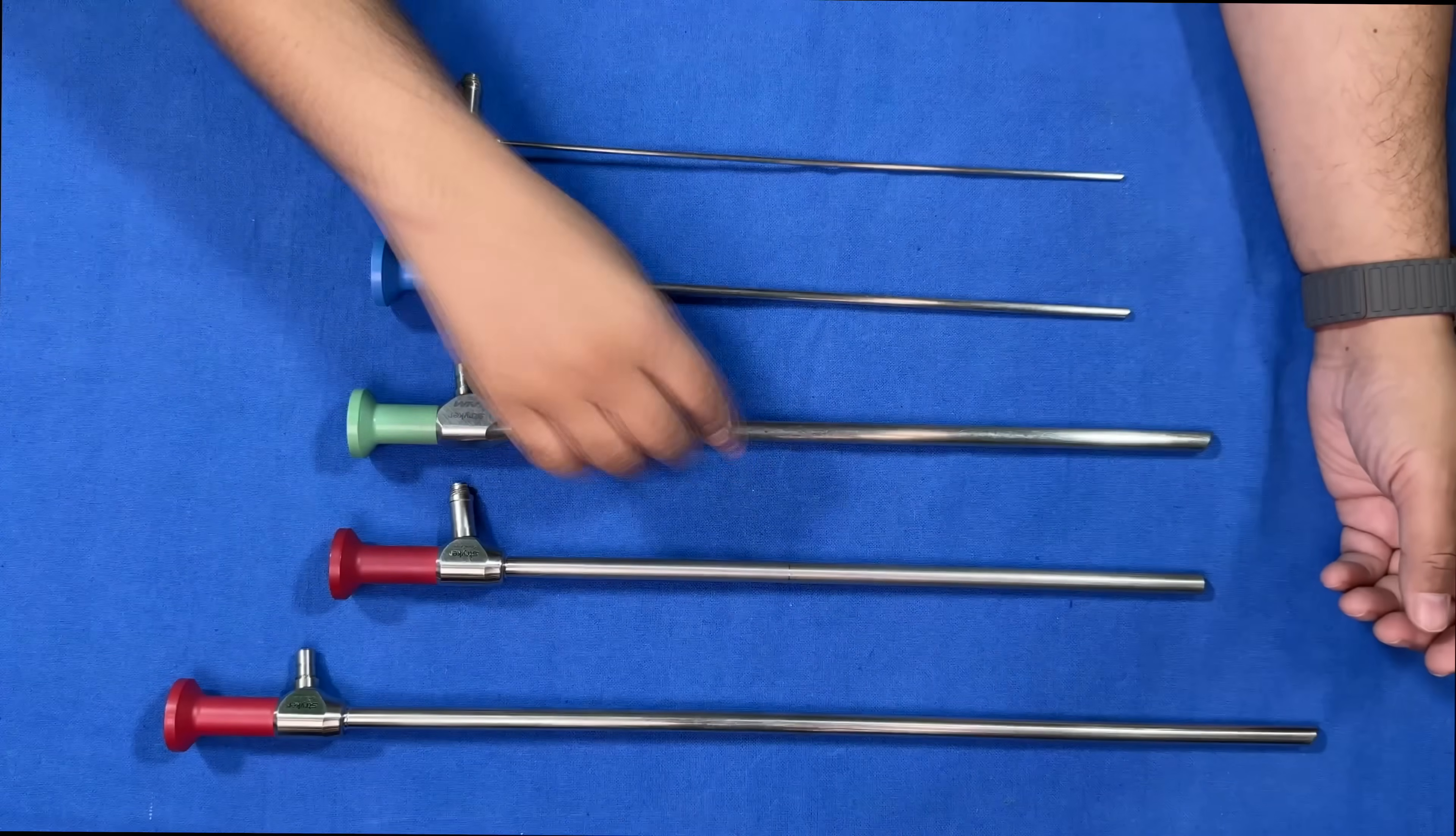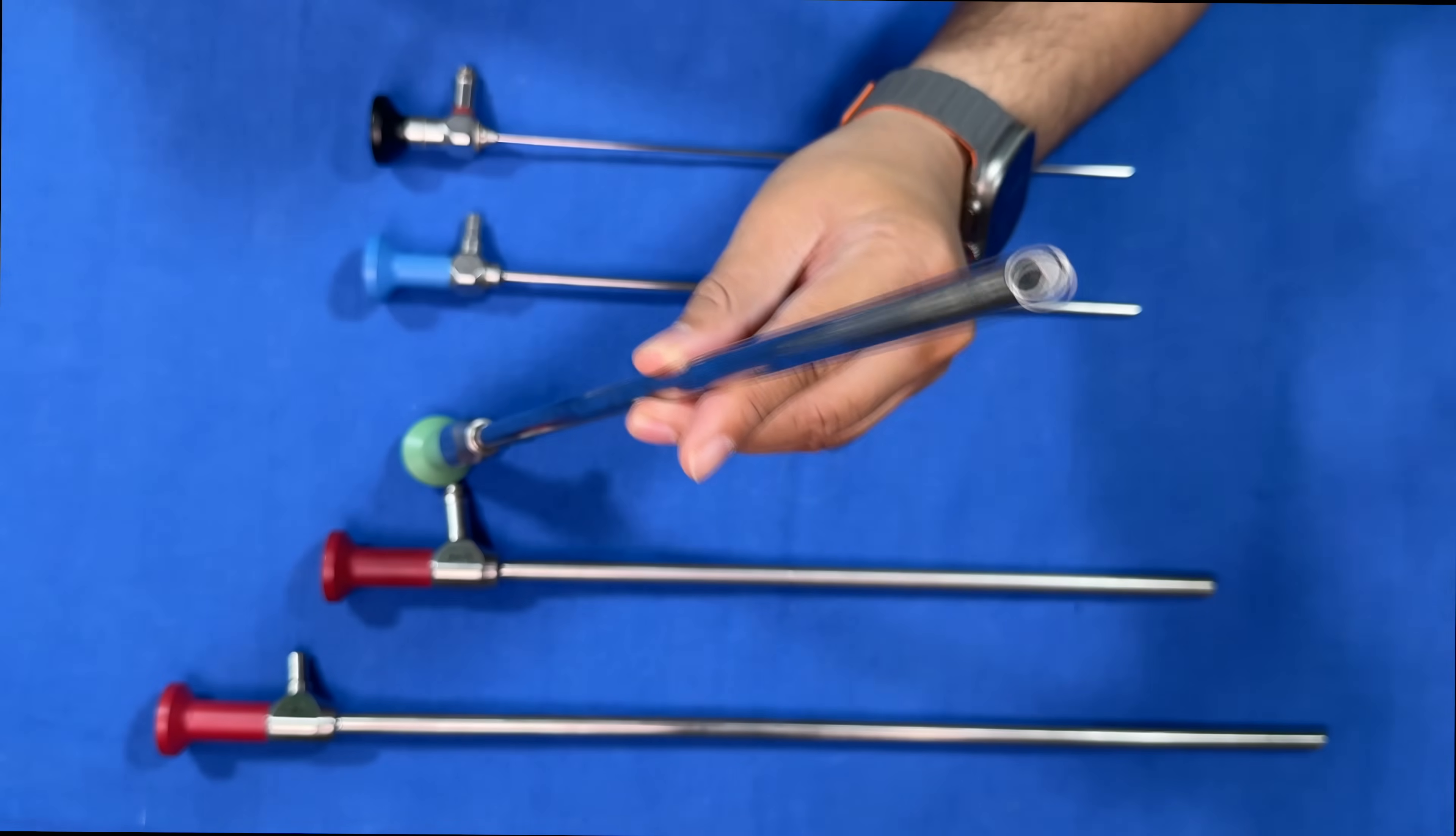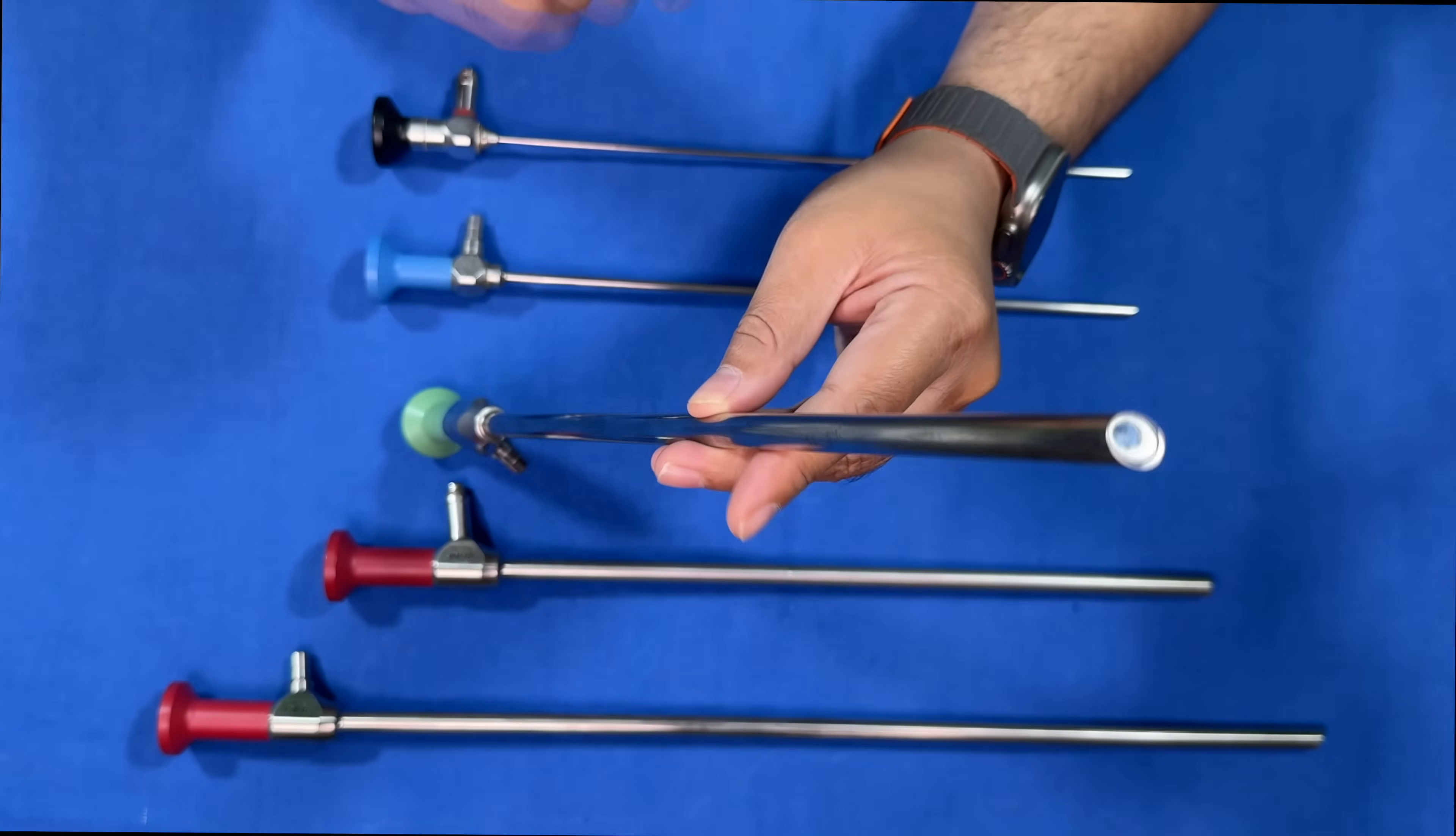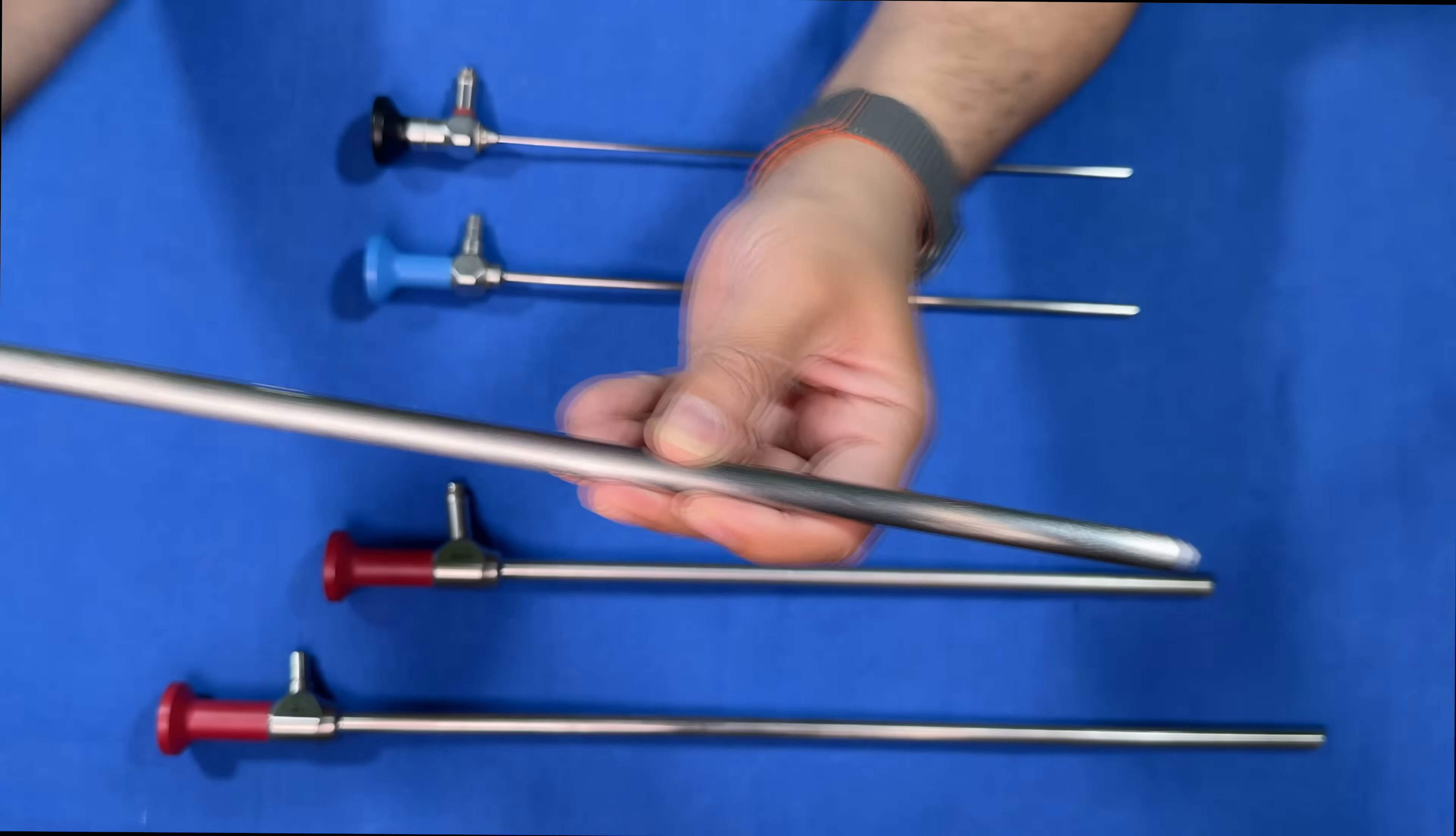These ones have angles. If you see, this scope is actually cut at an angle of 30 degrees. You may have 30 degrees or even 45 degrees, but the most commonly used is 30 degrees. The advantage is that when you have a straight scope, you tend to look a little downwards.